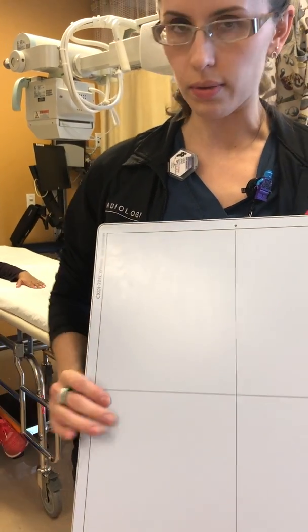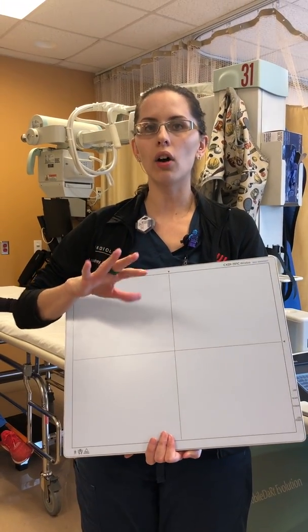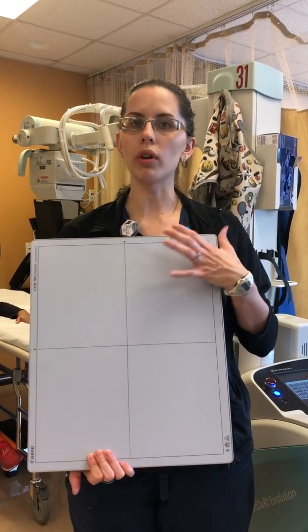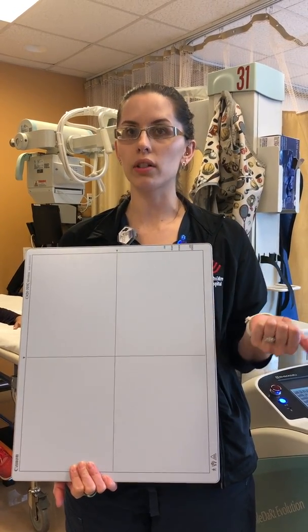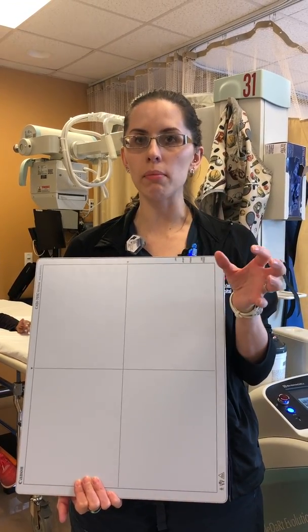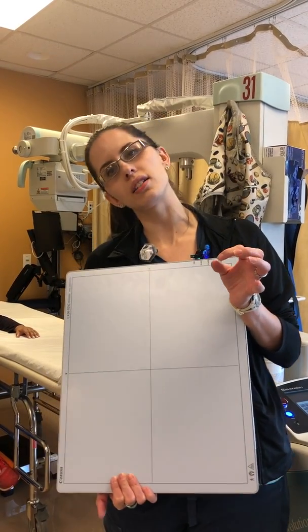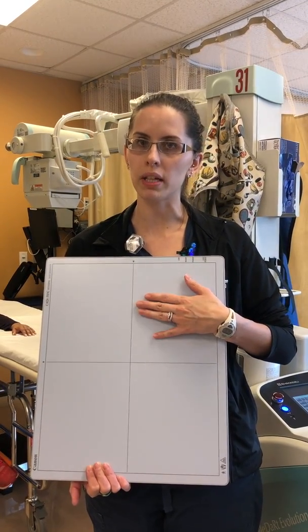And then on the crosswise orientation, this is going to be your top. So when you take your x-ray and all of a sudden it comes up on your screen flipped around, this is why. So be mindful of the orientation of the image on your cassette, because it's going to affect what you see and ultimately affect our radiologists as well. We can't incrementally manipulate or rotate our images. It's only a 90-degree rotation. So it makes it very cumbersome sometimes when the radiologists have to turn their heads different ways, so try to be more mindful of how you're taking your x-rays on your plates.